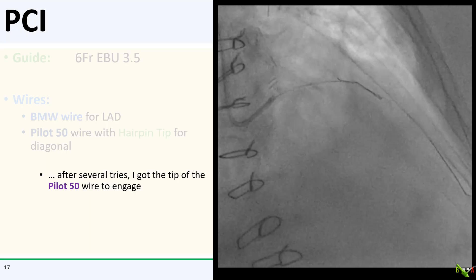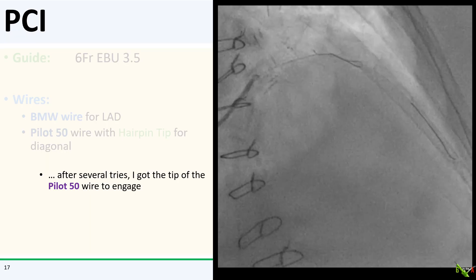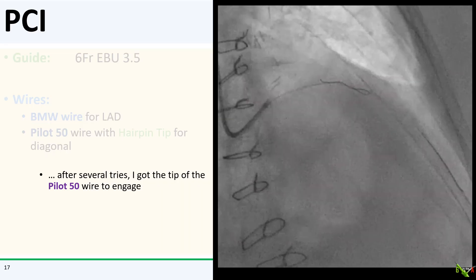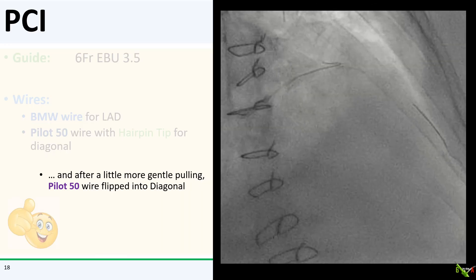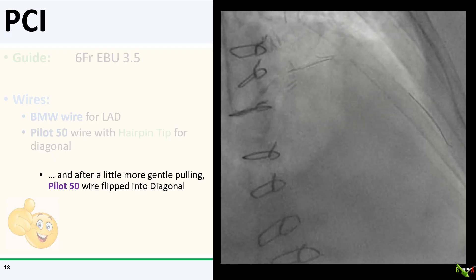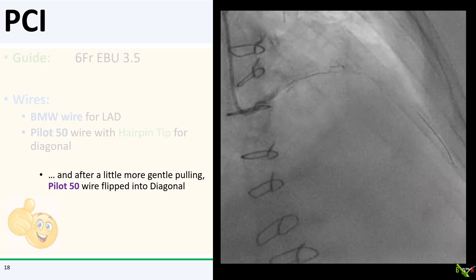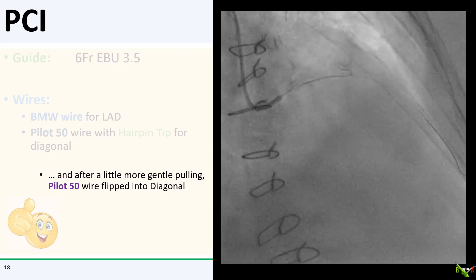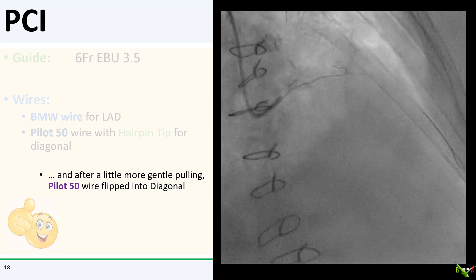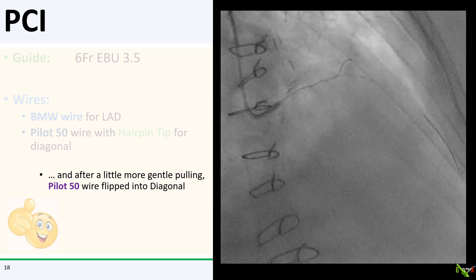Finally, after several tries, I got the tip of the Pilot 50 wire to engage the mouth of the diagonal. After a little more gentle pulling and prodding, I finally got my Pilot 50 wire to flip into the diagonal. Once I had enough tip in there, I had no difficulty advancing the wire further down the diagonal branch.